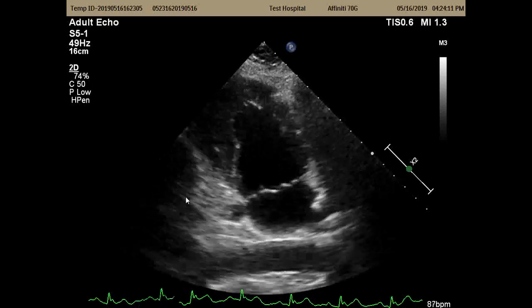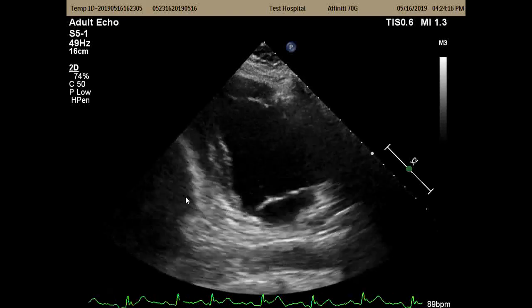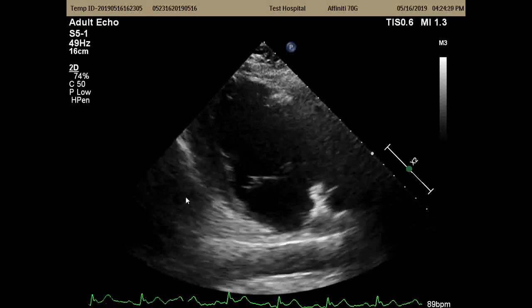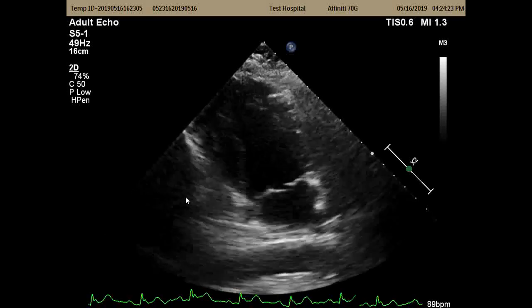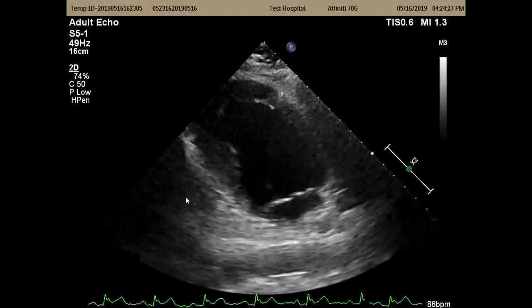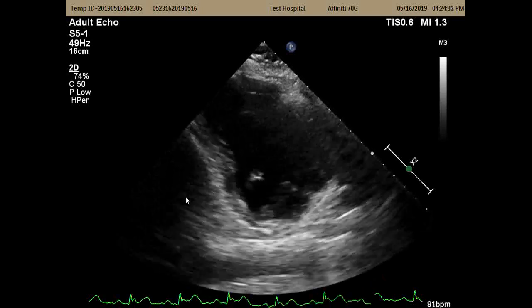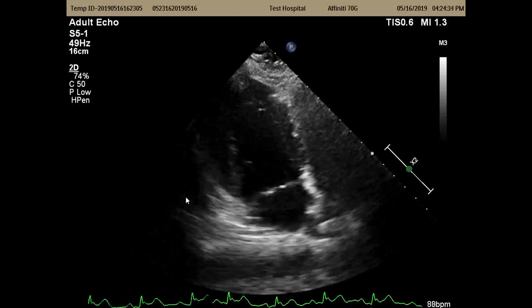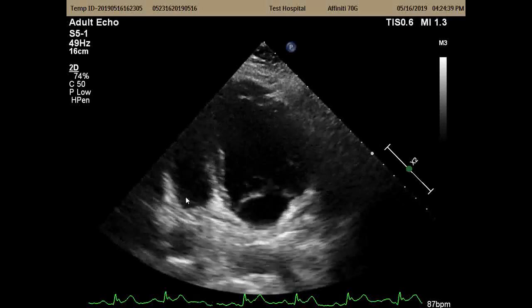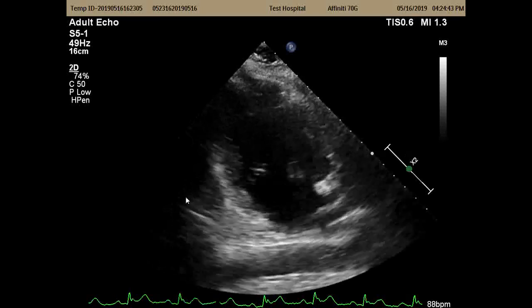So that's his aorta. If you can see his aorta at the bottom of the screen, that typically means you're a little high. So if you look, the chamber looks nice, it's pretty, but I'm very high. The ventricle should have a bit of a bullet shape at this point. So if you can see the apex of the LV is off to like the top left side right there. And so if the chamber looks too long and narrow or too rounded, or if you start seeing this guy, the RV, you're under-rotated. So you want to be fully rotated.